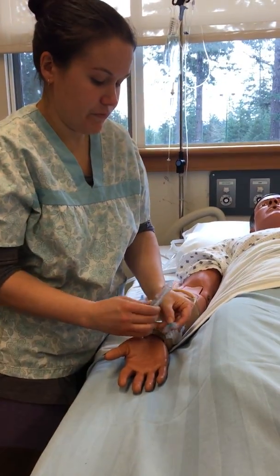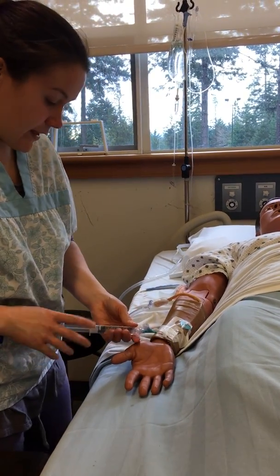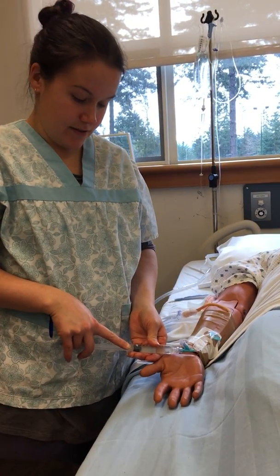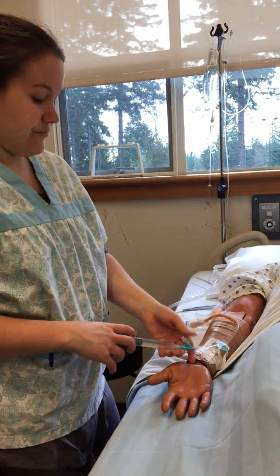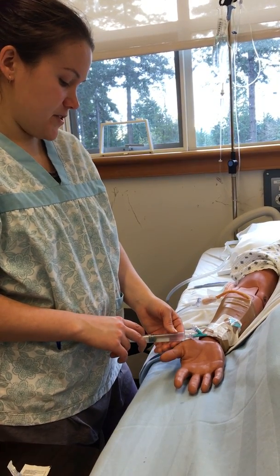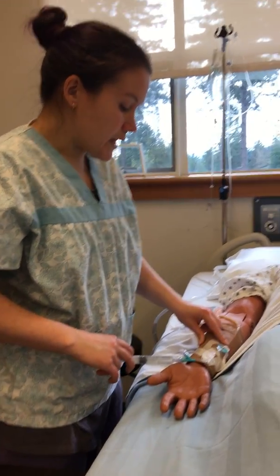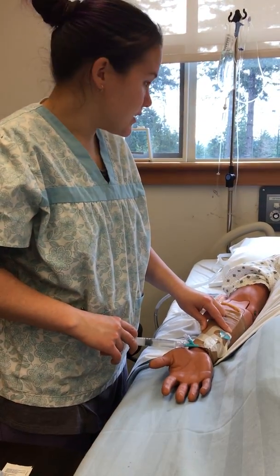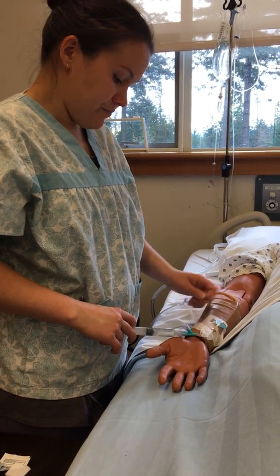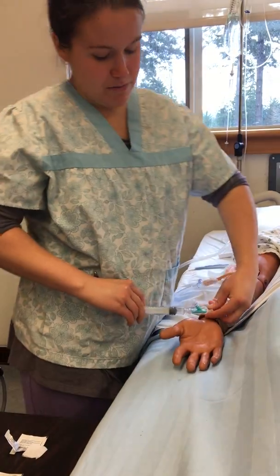Unclamp. Use a no-touch technique as I attach. Then I'm going to aspirate, looking for blood return. And then I'm going to push 1 to 2 mils, ever so slowly. And I'm assessing the site. I'm looking for swelling, coldness, infiltration, phlebitis, asking the patient, does that feel okay? Does that hurt? Okay. And then I'm going to do the push, push, pause thing to push it under pressure. Clamp under pressure, good.